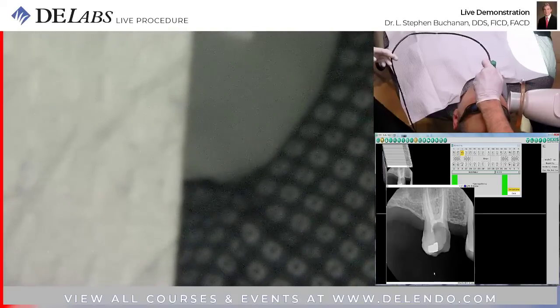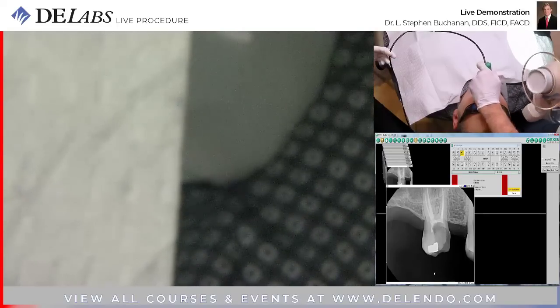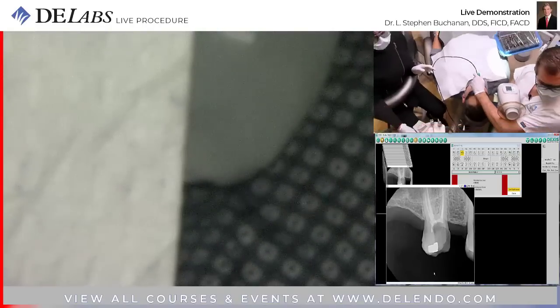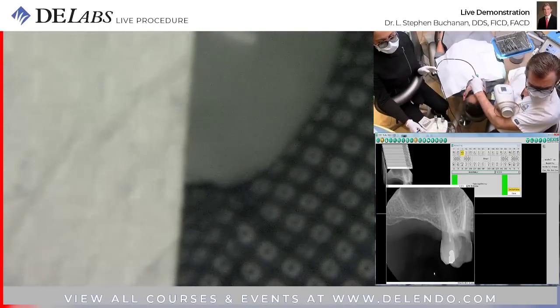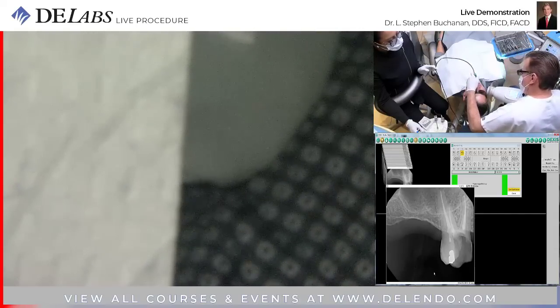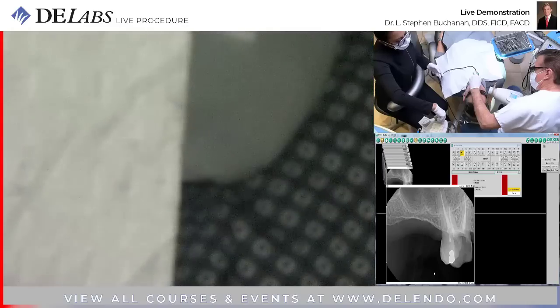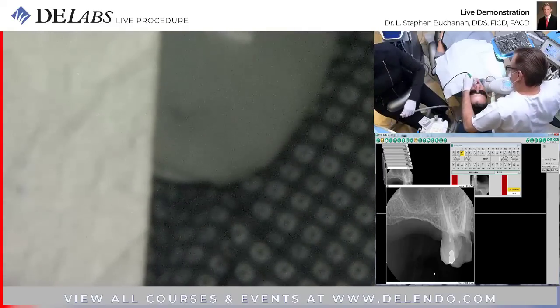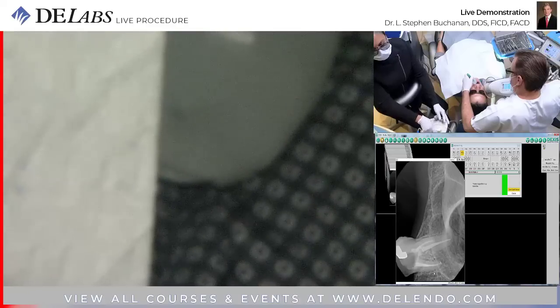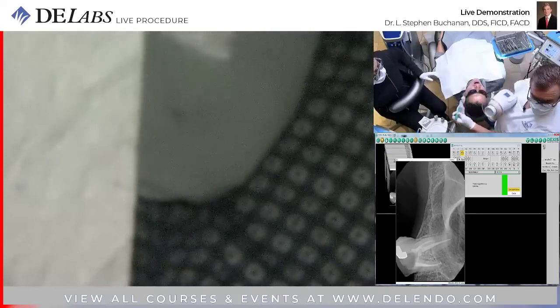Too high? No, go higher. Okay. That last one, look.